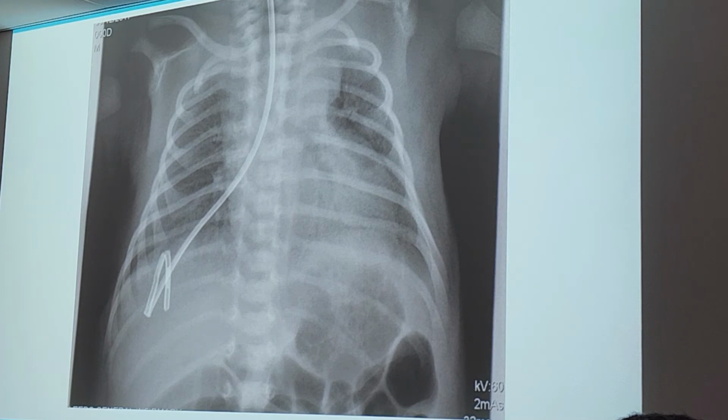Have you seen them do that? Those look like pretty sharp kinks though, as opposed to the other ones that were kind of rounded. Yes, they look like folded, like bent really bad. So when they take that one out, would it cause some scratches or inflammation that could cause bleeding? Well, they should inspect the tube to make sure that it's not ripped or torn before they reinsert it, hopefully.